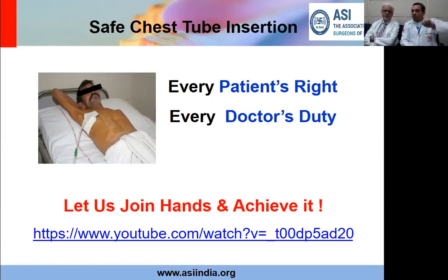Only thing I would say, blind putting of stitches may not help. You need to enlarge the incision, proper exposure, proper light. Ask for some help. If you've done it, there's some bleeding, you may be under pressure, so it's nice to have your senior or somebody walk in and assist you. And if it's going inside, then of course it's coming out in the chest tube. You won't be able to know whether it's actually an intercostal bleed or a lung bleed or which bleed. Then the patient will probably merit an exploration.